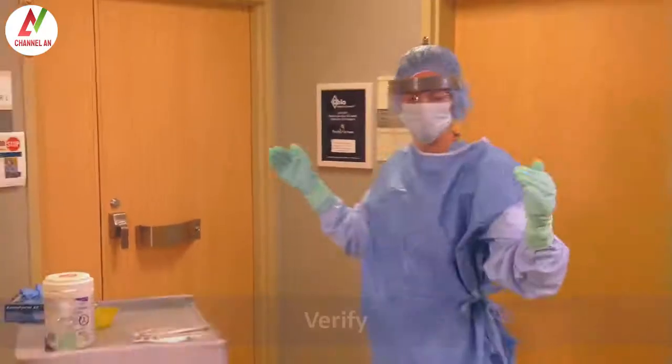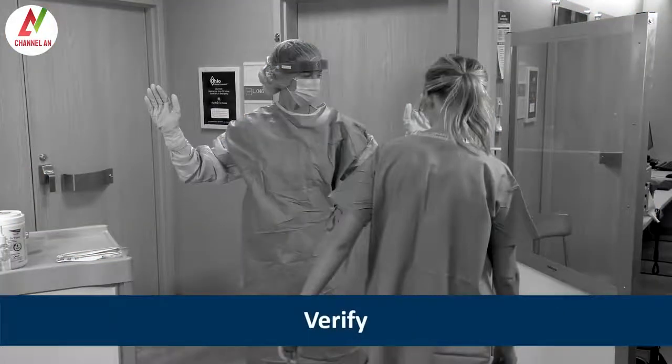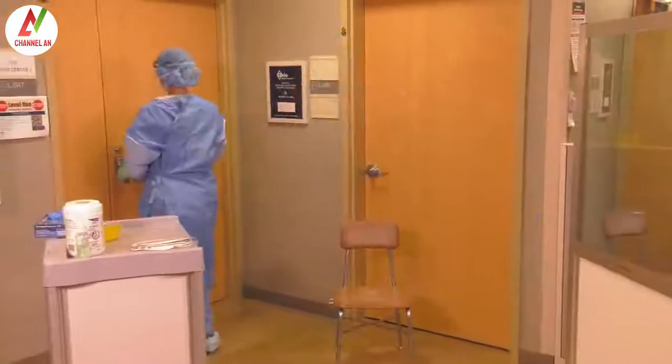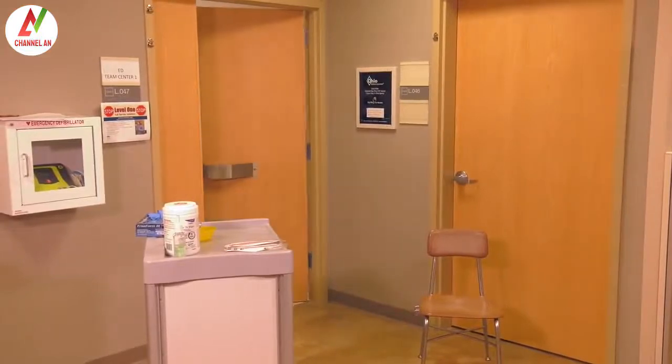Heather asks Angie to help verify the integrity of the PPE ensemble. Heather makes sure she is comfortable and able to go through a range of motion while remaining correctly covered. Heather is ready to enter the Level 1 Full Barrier Isolation Room.